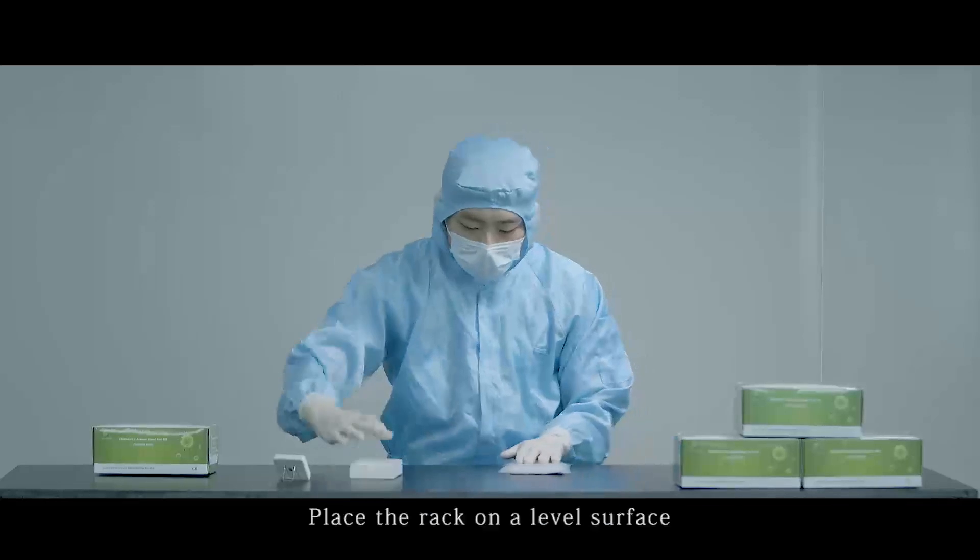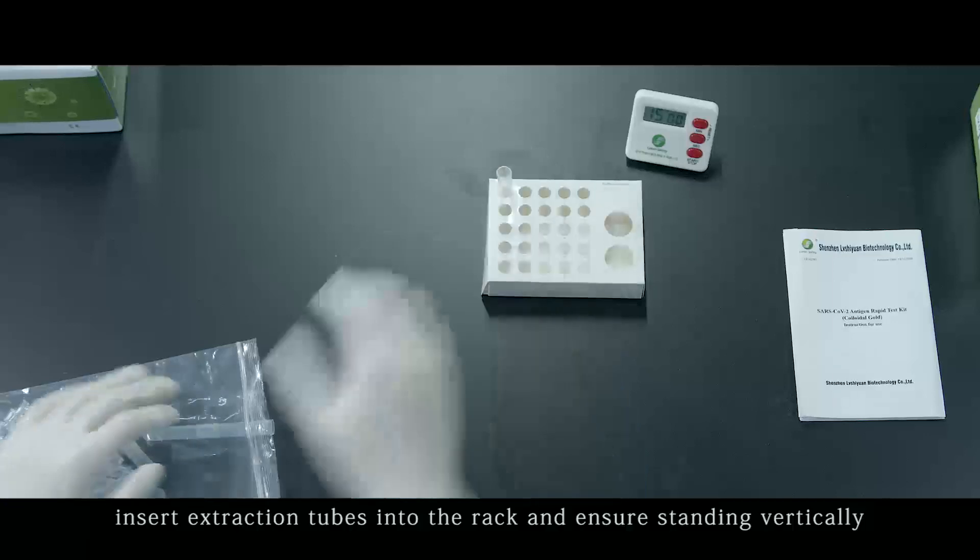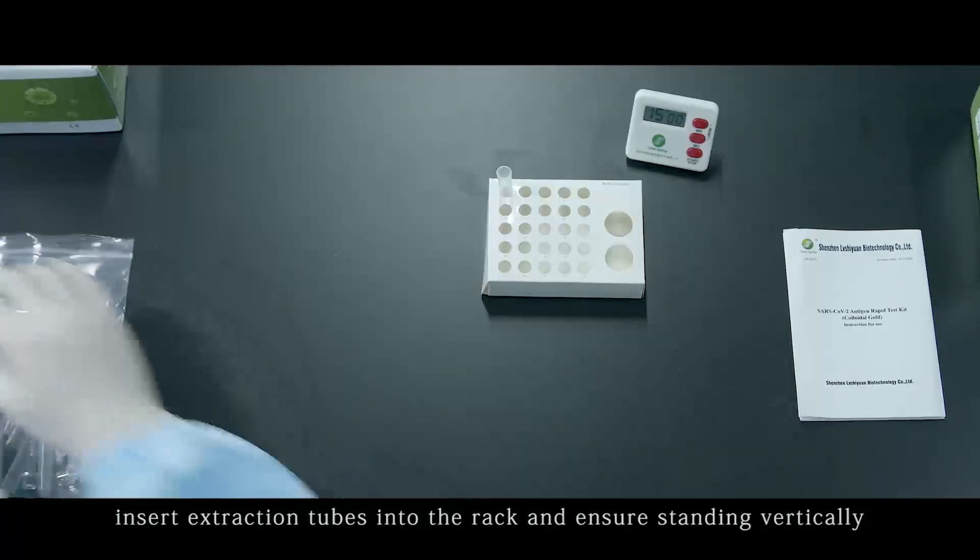Place the rack on a level surface. Insert extraction tubes into the rack and ensure they are standing vertically.